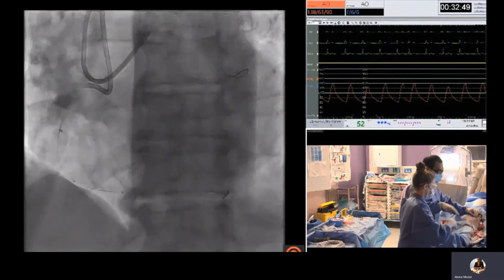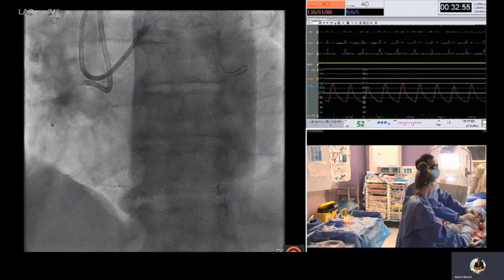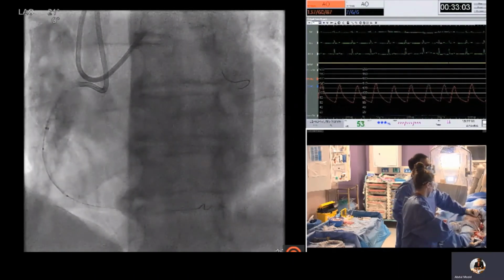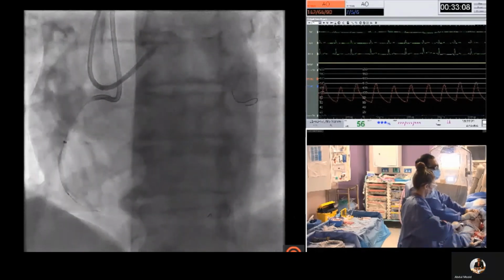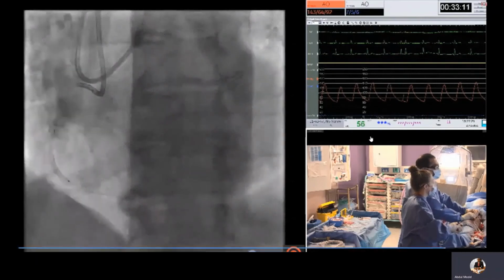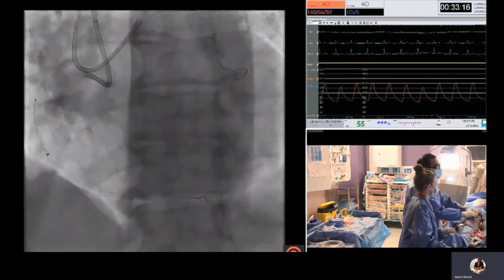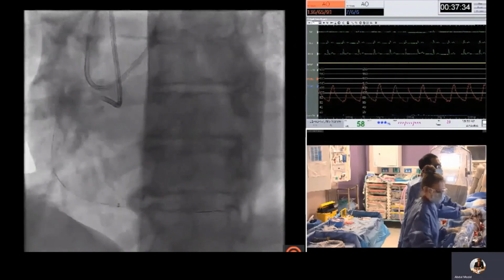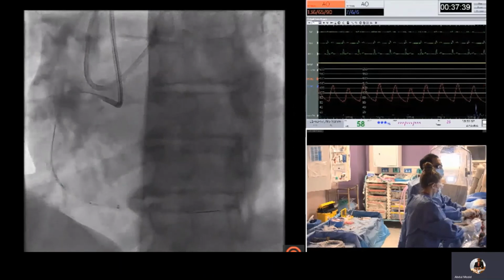The occlusion length was pre-dilated with a 3.0 mm balloon. And the Trapliner was introduced further. You can still see that there's no bleed pressure trace, so there is clear damping of pressure, which has helped maintain the size of the distal vessels and has prevented significant hematoma from developing.